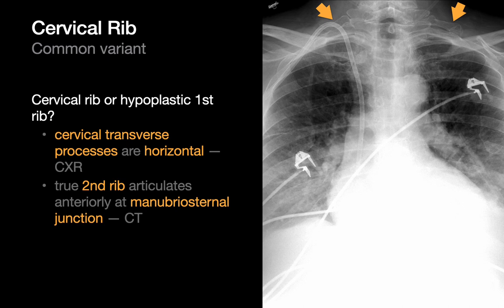A common mimic when diagnosing cervical ribs are hypoplastic first ribs coming off of the T1 vertebra, since they'll often look a little unusual and cervical rib-ish. A helpful tip for telling a cervical rib apart from a hypoplastic first rib on chest x-ray is to look at the transverse process that rib is articulating with. The transverse processes of thoracic vertebral bodies tend to point upwards, while the transverse processes of cervical vertebral bodies generally point more horizontally.